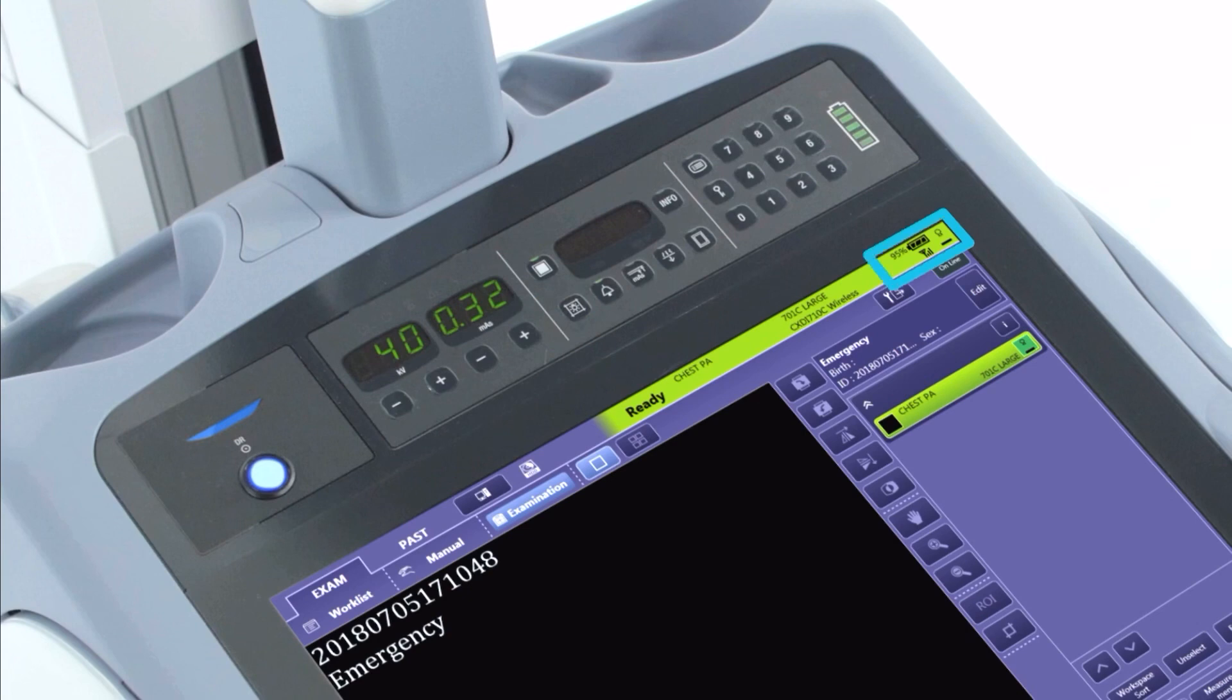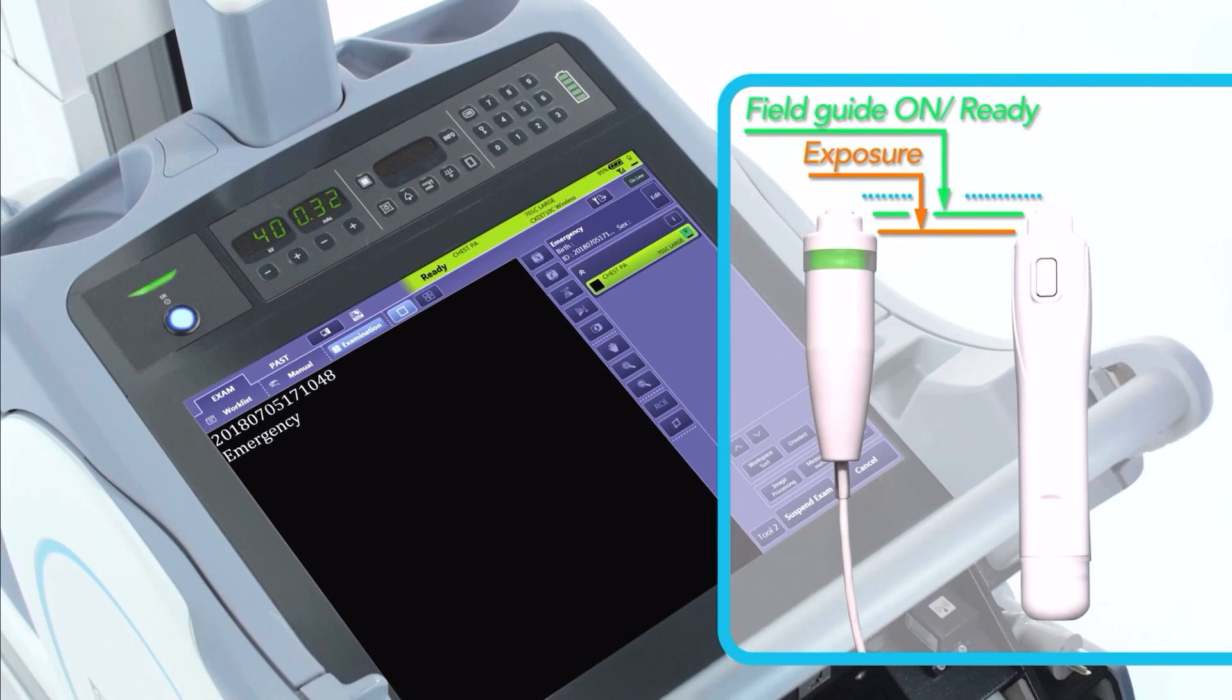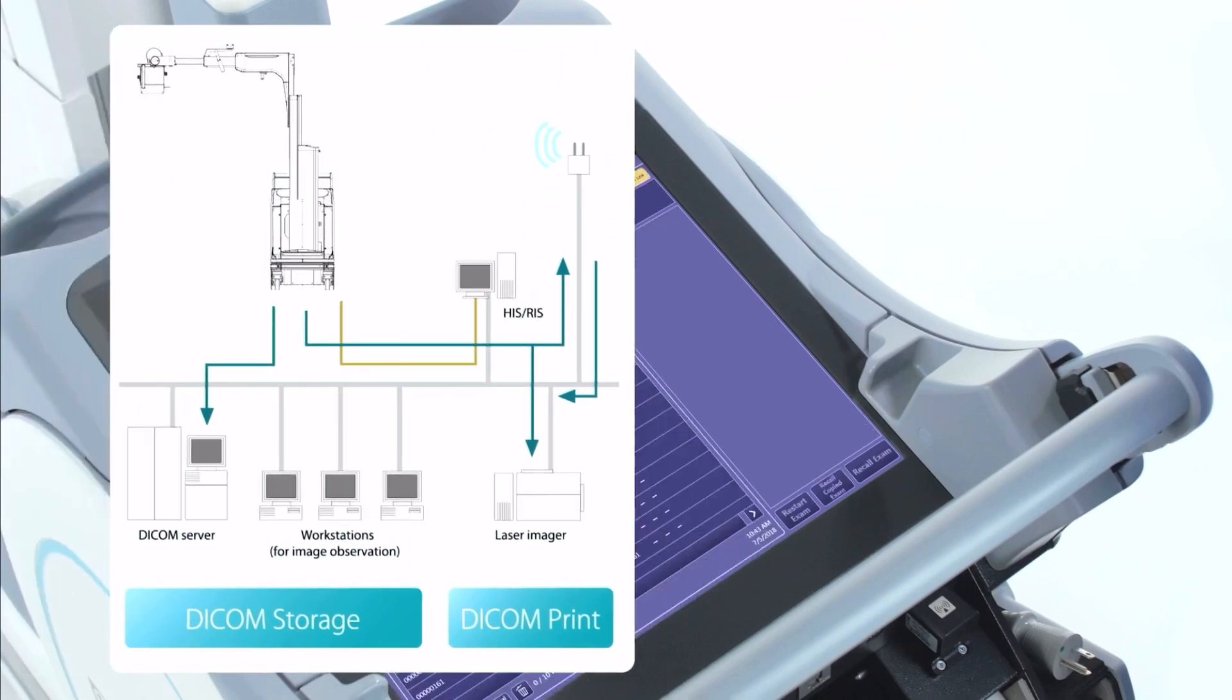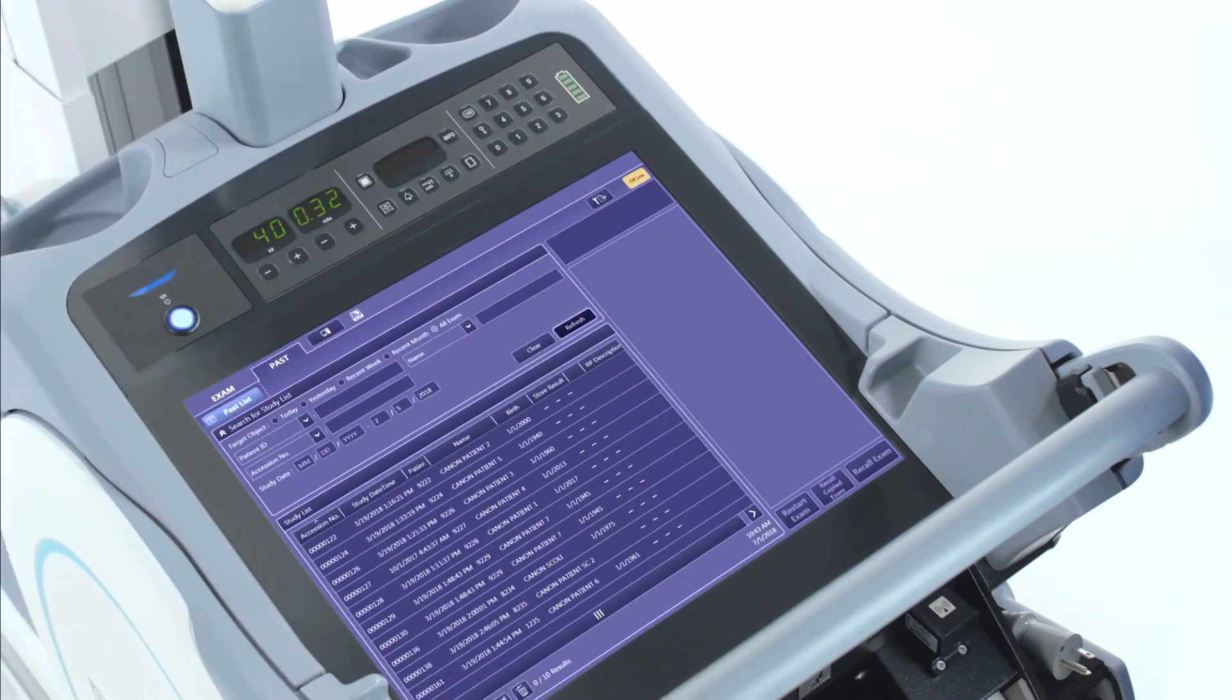On the top of the digital screen, you can find an indicator for the signal strength between the panel and the unit. A green indicator lets you know that the system is ready to make an exposure. Activate the exposure using the hand switch. Once you've made your exposure, you can send out the image wirelessly and then return to the main work screen to select your next patient.